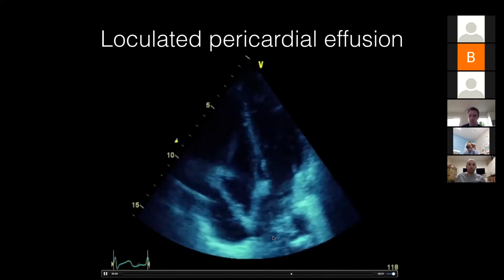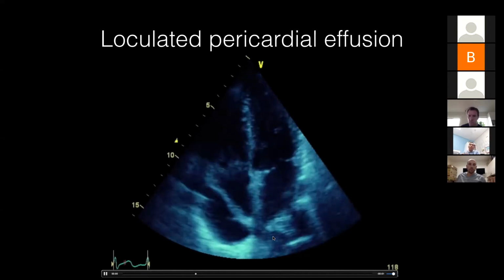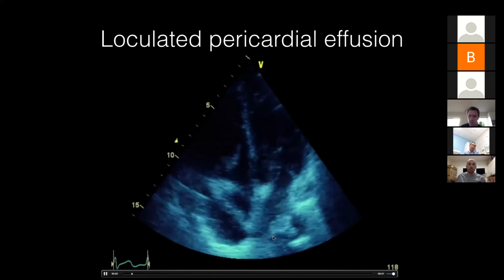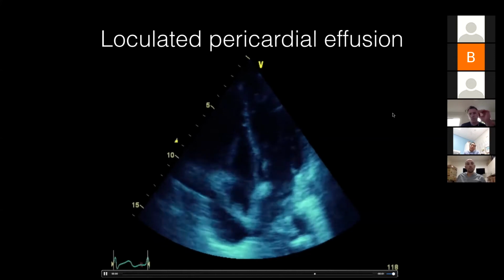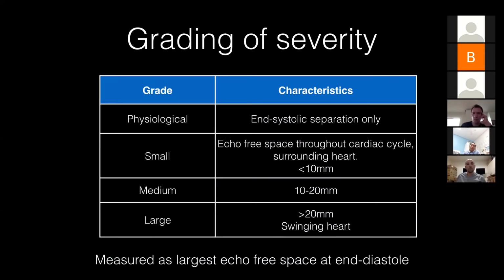And I think looking for transesophageal echo early doors in these patients can be useful. Or as I was saying before, subcostal imaging I've found the best, or just an off-axis view, getting an image any way you can. But calling for someone who can do transesophageals is really useful. Okay, so that's how to diagnose it. So clinical diagnosis, try and figure out what the cause of it is, and then look for the echo-free space of the pericardium, not a pleural effusion, not a fat pad.